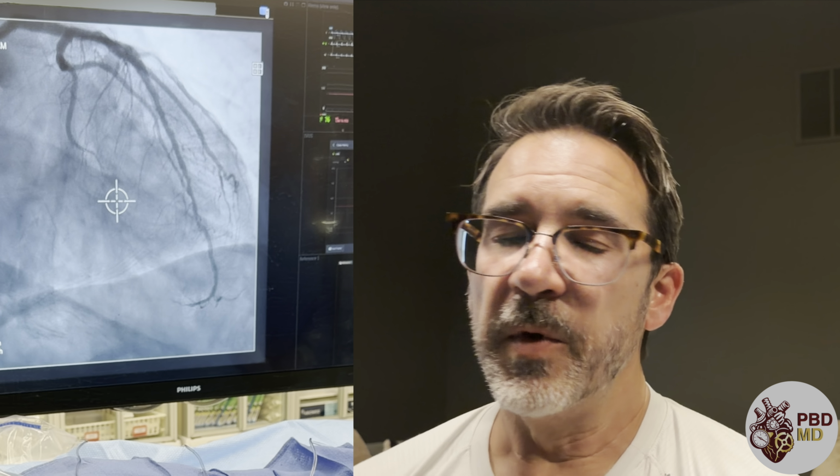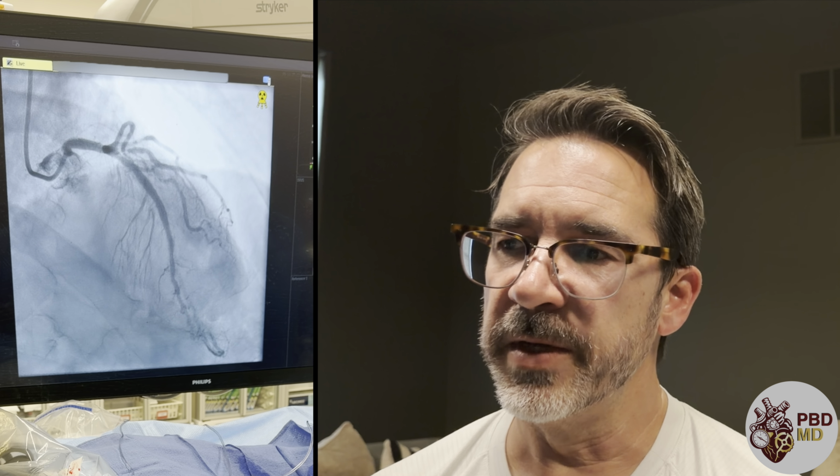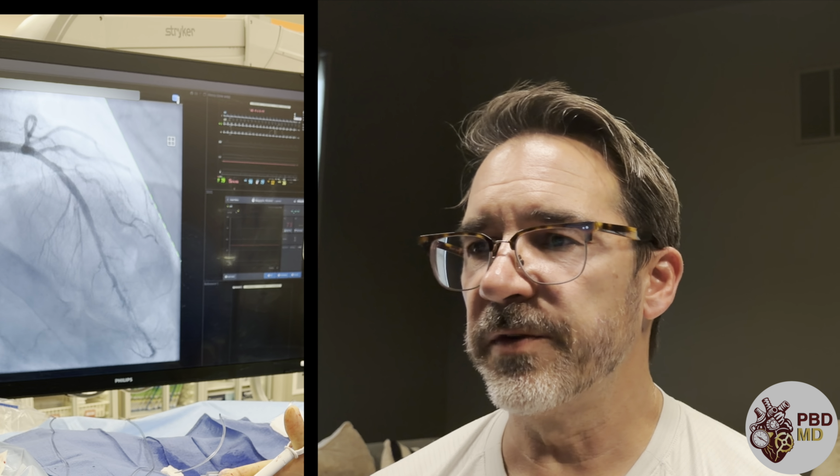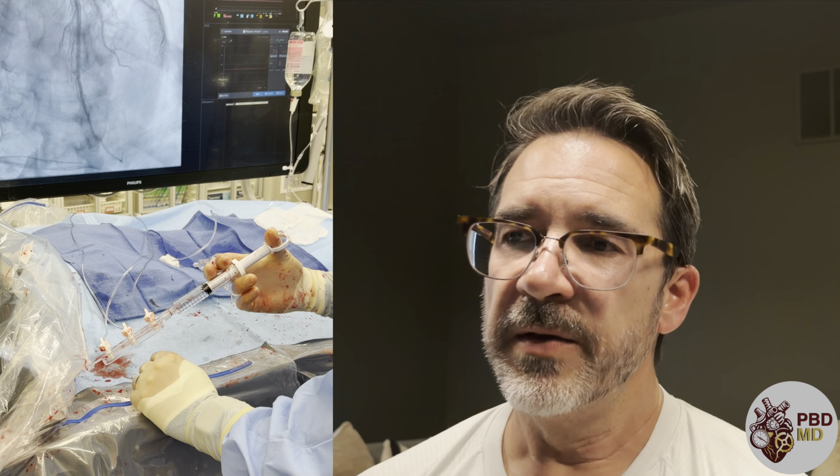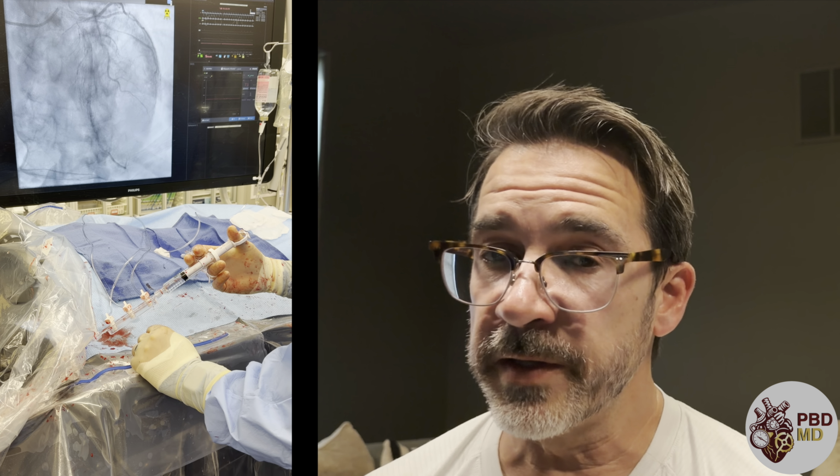In addition to that, there's a circulating nurse who's watching oxygen saturations and making sure the patient's comfortable, giving medications as needed. Most of the time for these procedures, patients are awake. Some very awake. Some people even do it without medication, which is fine. Typically, the vast majority of people are going to get just a little bit of Versed and fentanyl at least. But we're frequently having conversations, talking back and forth as we're doing the procedure. Good news is it usually is not painful.